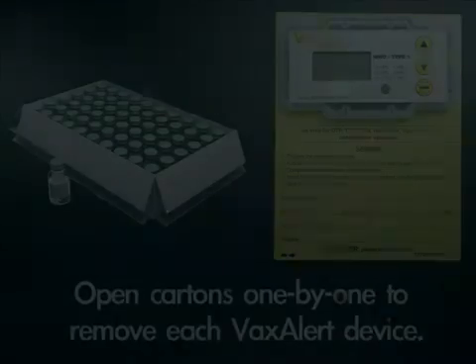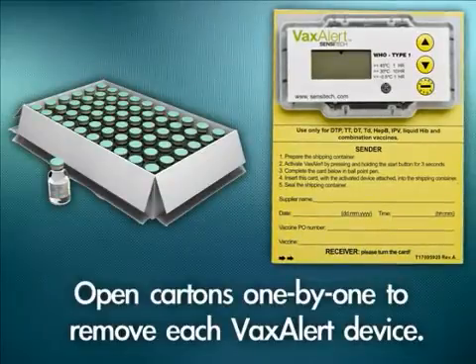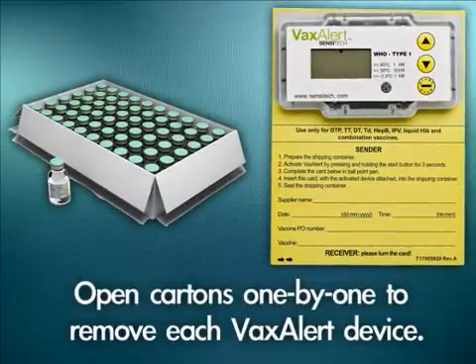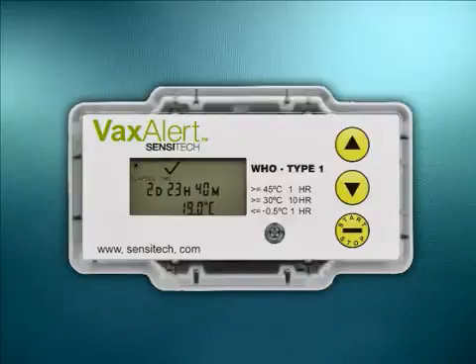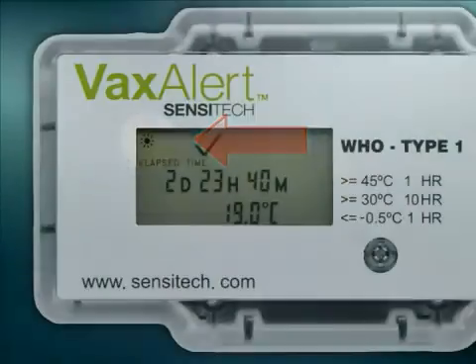When you receive an international vaccine shipment, you must open all the cartons one by one to remove each Vaxalert device. When you remove the indicator from the carton, you will see the run signal at the top left corner of the screen, which means that the device is in active measurement mode.